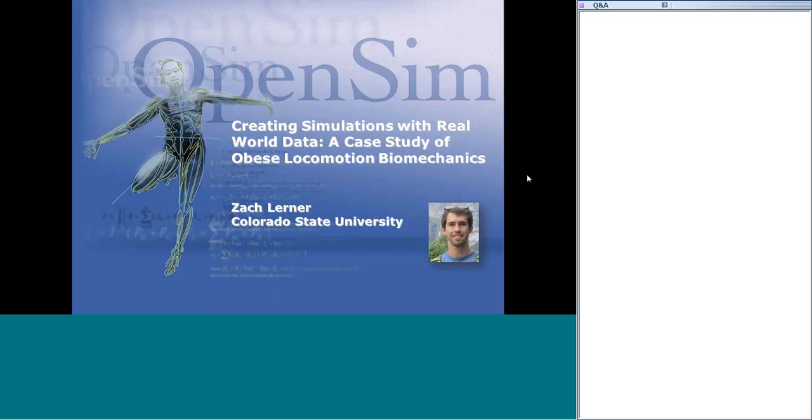Okay, thank you, Jen. Hi everyone, my name is Zach, and I'm really excited to be giving this webinar talk. Today I'll be discussing some OpenSim basics, and I'll be using our analysis of the locomotion biomechanics of obese adults to highlight the functionality of utilizing OpenSim to run musculoskeletal simulations.